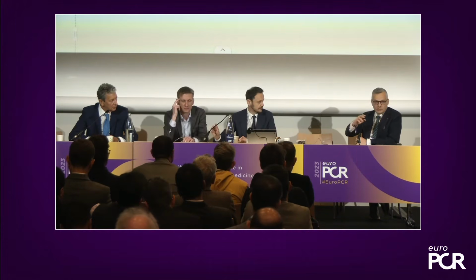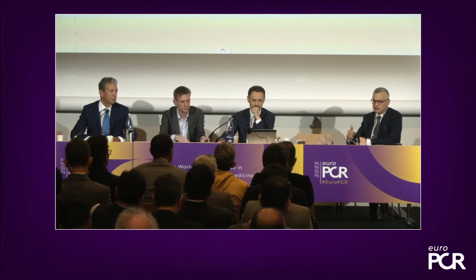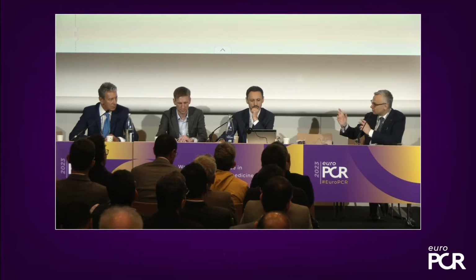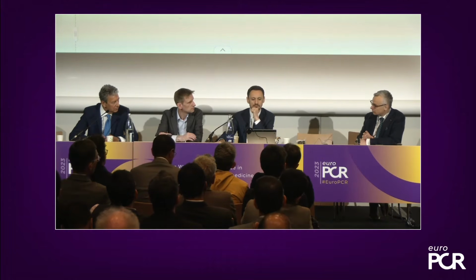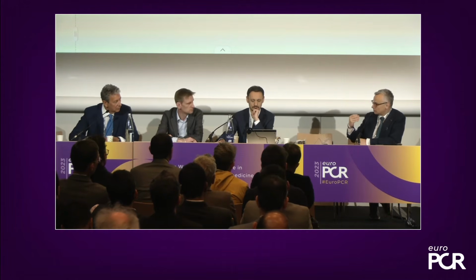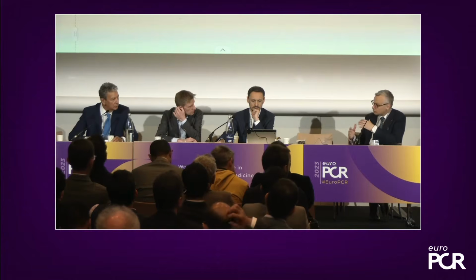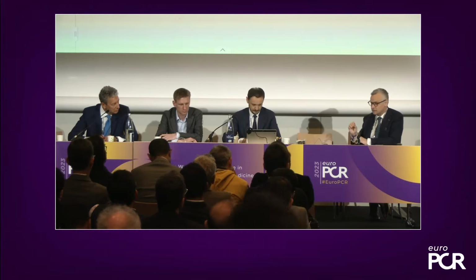There is a learning curve, right? Obviously, to have a good echo-guided puncture, and at the beginning you will probably get worse punctures using echo until you get used to it. And there are little differences also in the flow. For instance, I rarely use the longitudinal view because you can get the same impression of the diving by scrolling. But anyhow, in my opinion it's very important at the end to puncture the anterior wall, and that is really seen only in a transversal view.